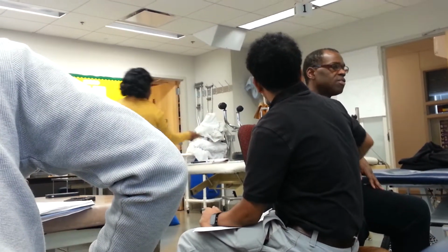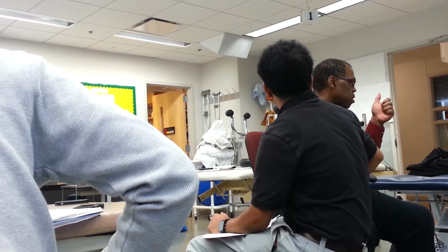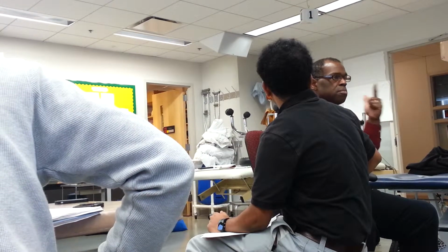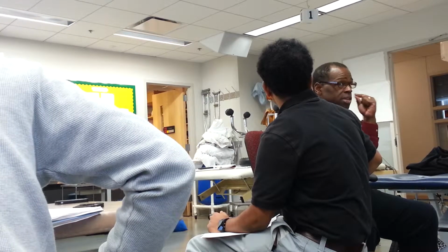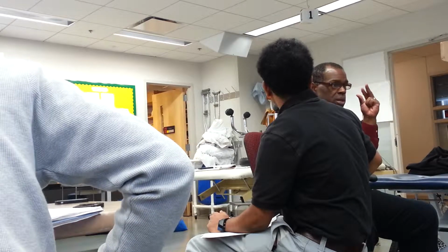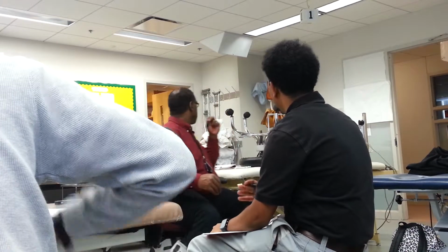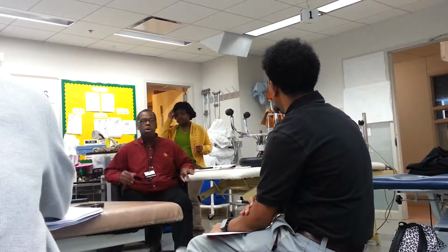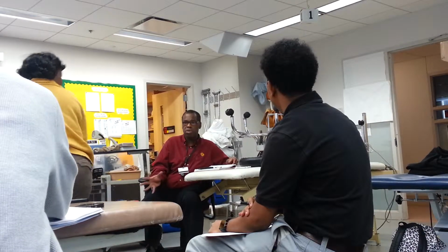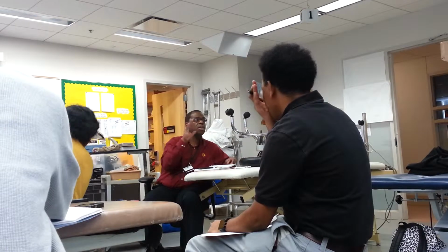So the twitch would take care of chronic pain, 2 to 4 pulses per second. 50 would take care of motor movement with no fatigue. 100 would take care of motor movement with fatigue. So the pulses per second is going to control what they feel. So if I have 200 pulse width, we know that's going to move it. If I'm getting a twitch, it has to be low pulse rate.